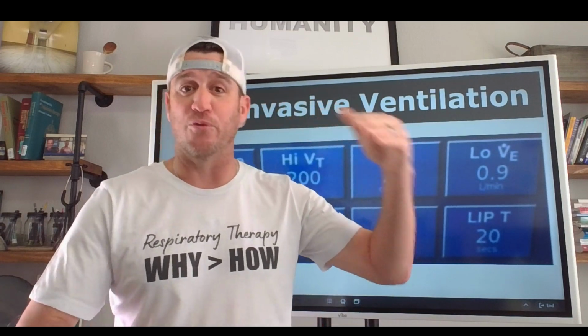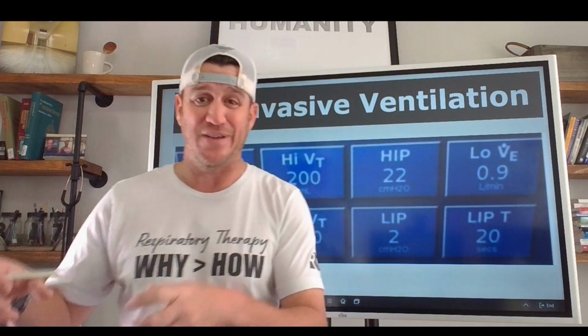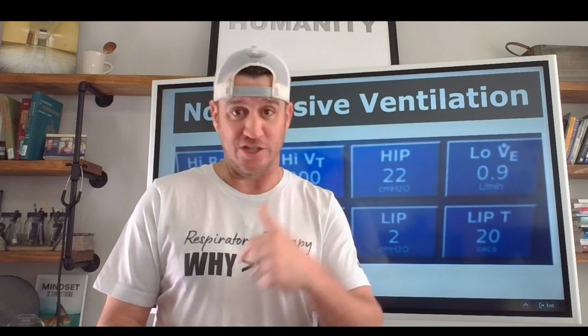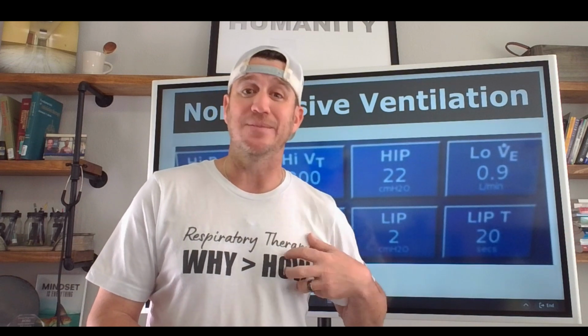200. Because I want to know if for whatever reason, just like with the respiratory rate, that patient's ability to take an effective tidal volume decreases and I see those tidal volumes start to fall, then I want to be alerted of that so that I know that there is a change that I need to be aware of. Again, just like with rate, tidal volume goes down, minute volume goes down, CO2 goes up. I need to be aware of this.